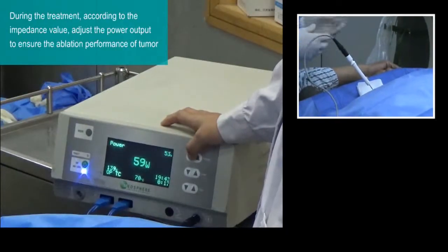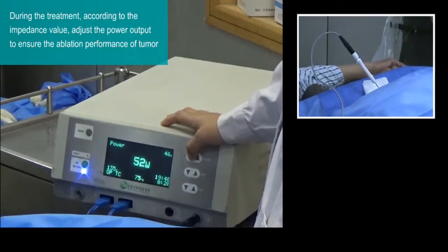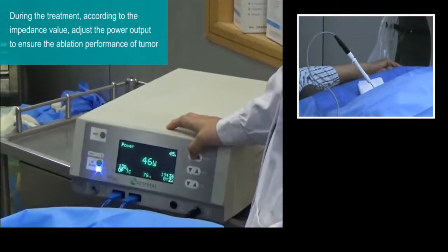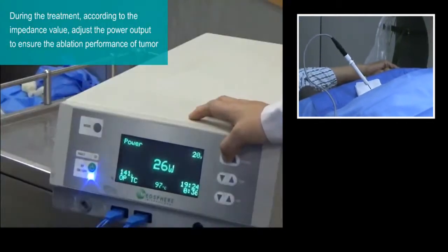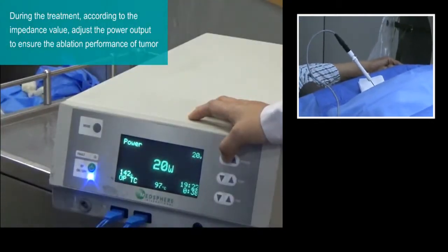During the treatment, according to the impedance value, adjust the power output to ensure the ablation performance of the tumor.